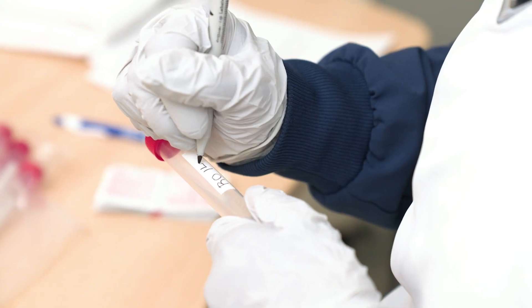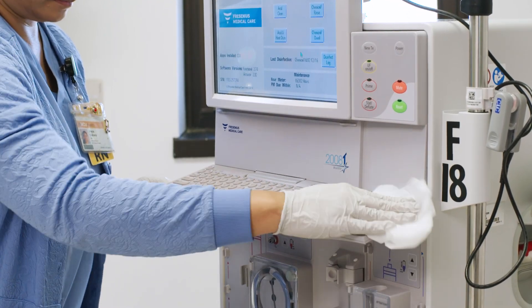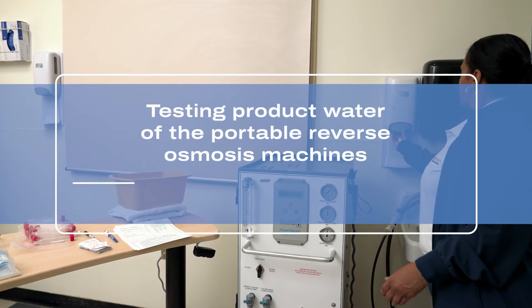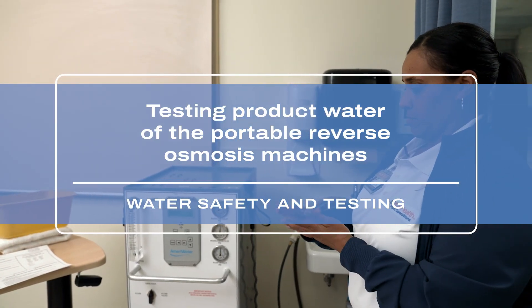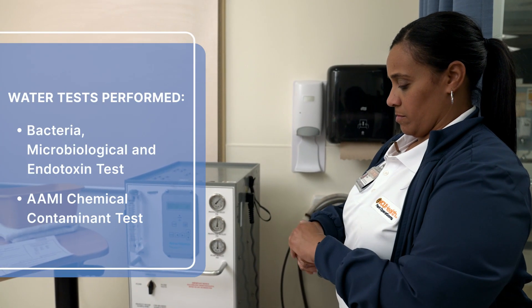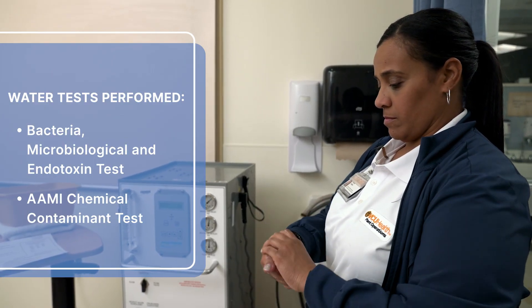To keep patients free from waterborne illnesses, frequent and proper testing and disinfection of the dialysis machines must be performed. In this video, we'll demonstrate how to properly collect samples for testing the Portable Reverse Osmosis Machines. The tests we'll be demonstrating are bacteria, microbiological and endotoxin tests, and an AAMI chemical contaminants test.